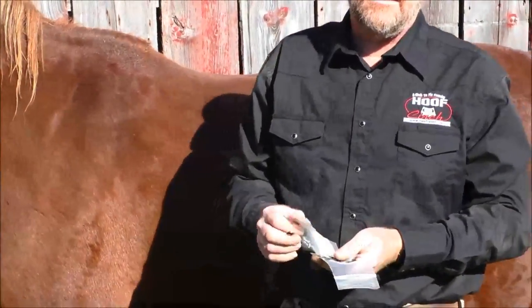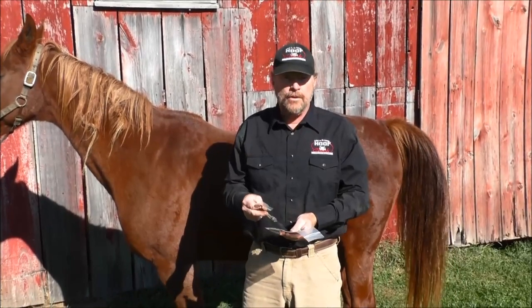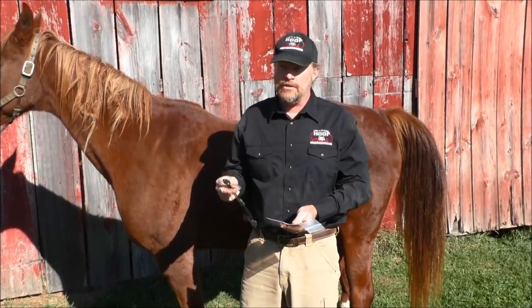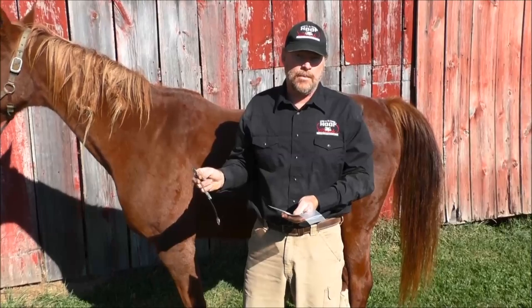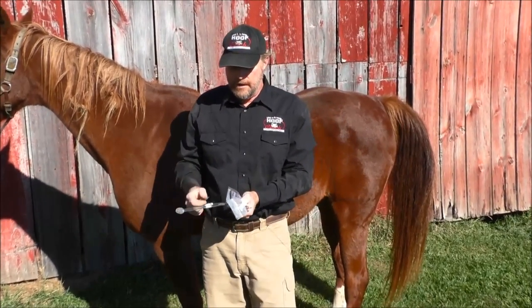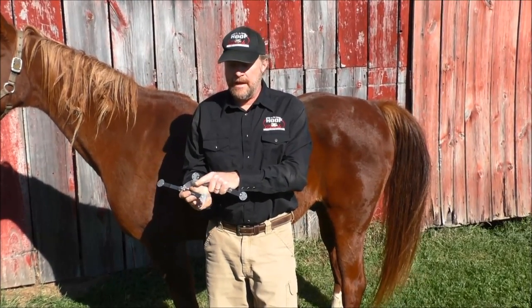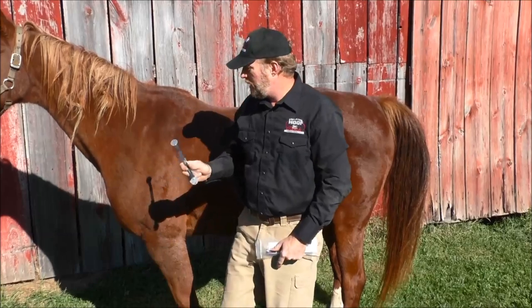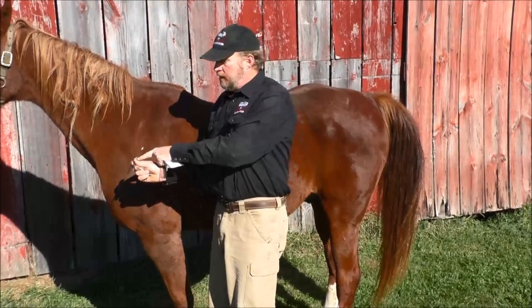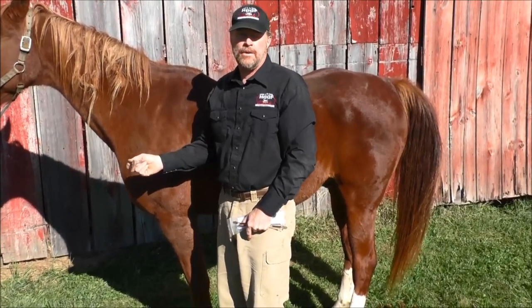The first foot we're going to do: we're going to act like he can't pick his feet up and do it with his foot on the ground — as if he's sore enough that you can't actually lift a foot to work on him. You can put these right on while he stands on the ground. You'll want to make sure that the tightening screw on the band always faces the outside of the horse, so you don't have to go underneath the horse to tighten the band.